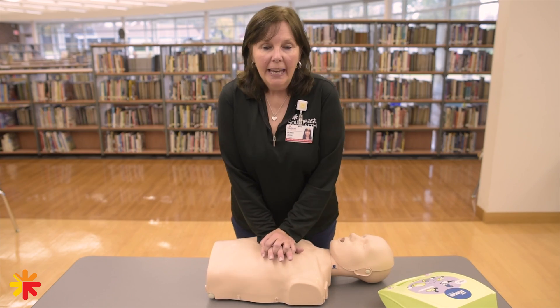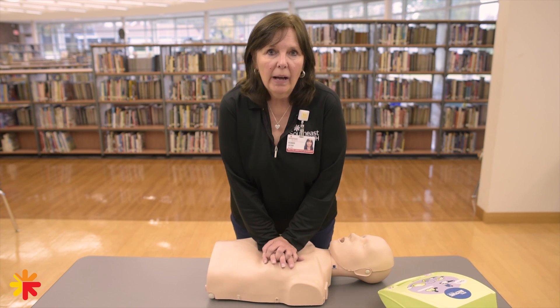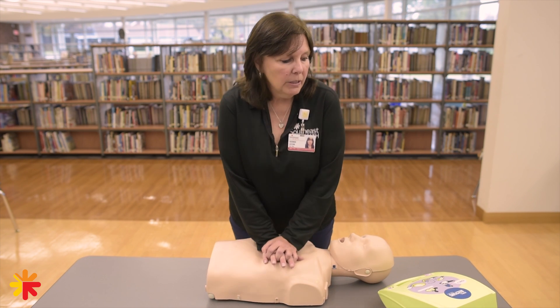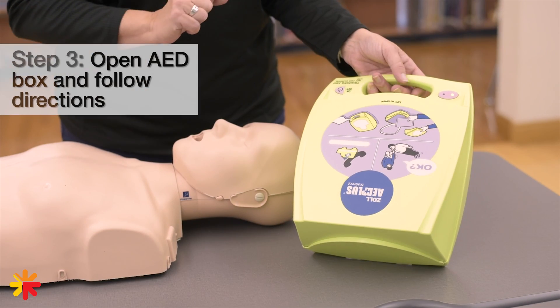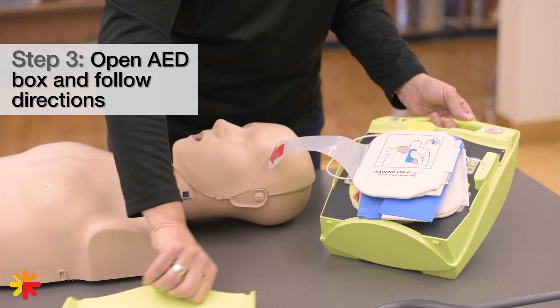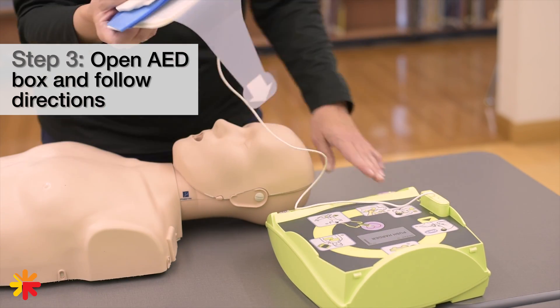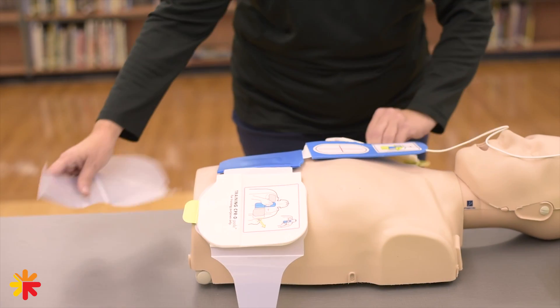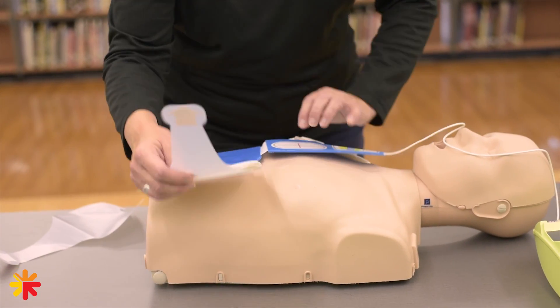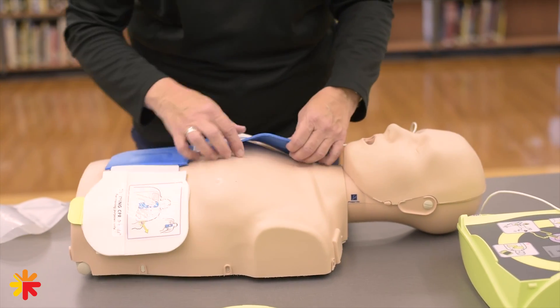Keep doing compressions when the AED arrives — as much as possible while the AED is being put together and placed on the patient's chest. This needs to go directly on someone's skin. So we're going to open it up, turn it on, and put the pads on the chest the way they're illustrated — they're basically crossing the heart.